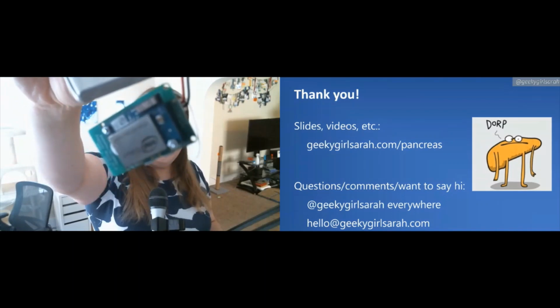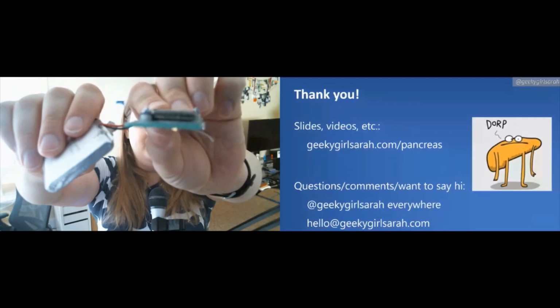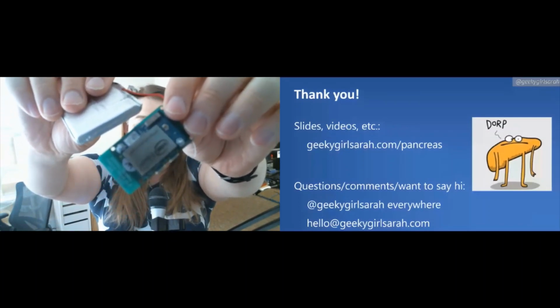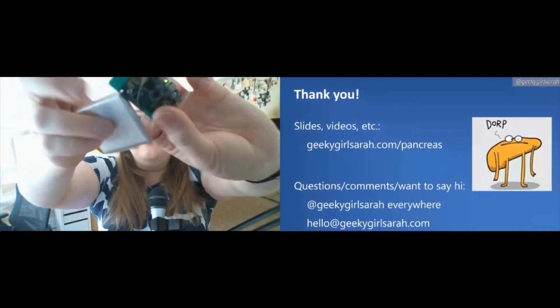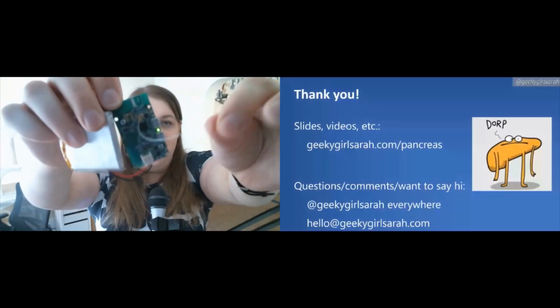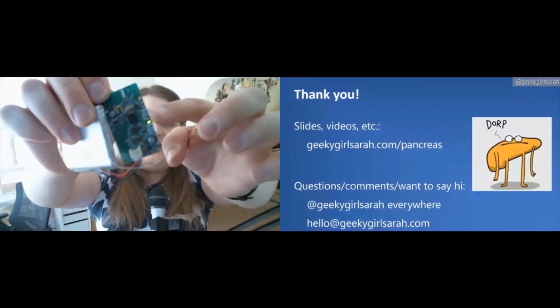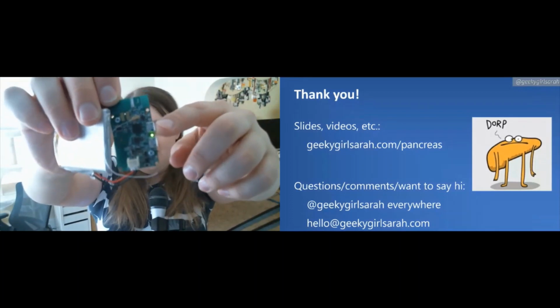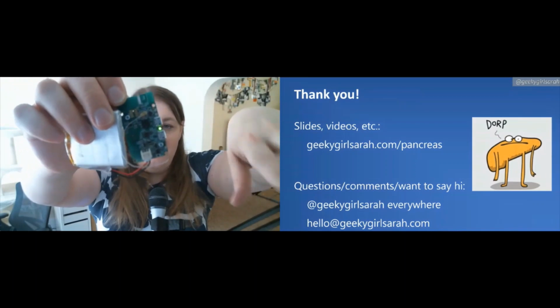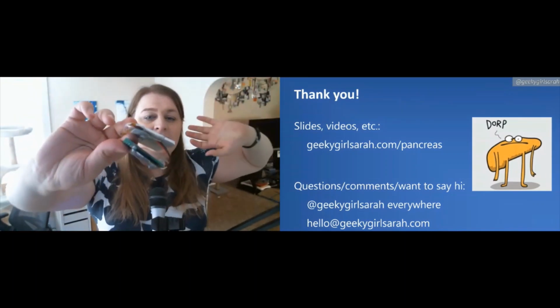So this Intel Edison, they don't make an Edison anymore, but that's just a processor slash whole system on one chip. It has memory and everything in it too. And then the back is the transmitter board. So this antenna is the 900 megahertz antenna that talks to my pump. And then I can connect to it for serial if SSH isn't working, or I can charge it with both of these. And this battery usually lasts almost entirely all day.